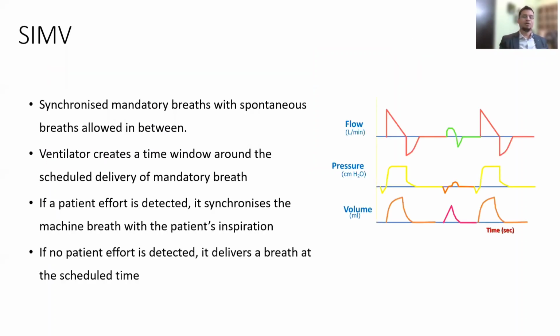Now let's understand the SIMV mode. Many people still use it. Synchronized intermittent mandatory ventilation. Here, two things are combined. Mandatory ventilation is still there. There is also a component of spontaneous breath, which is allowed inside the CMV, but between the two mandatory breaths. And this spontaneous breath is allowed, but it is synchronized. That is also important.